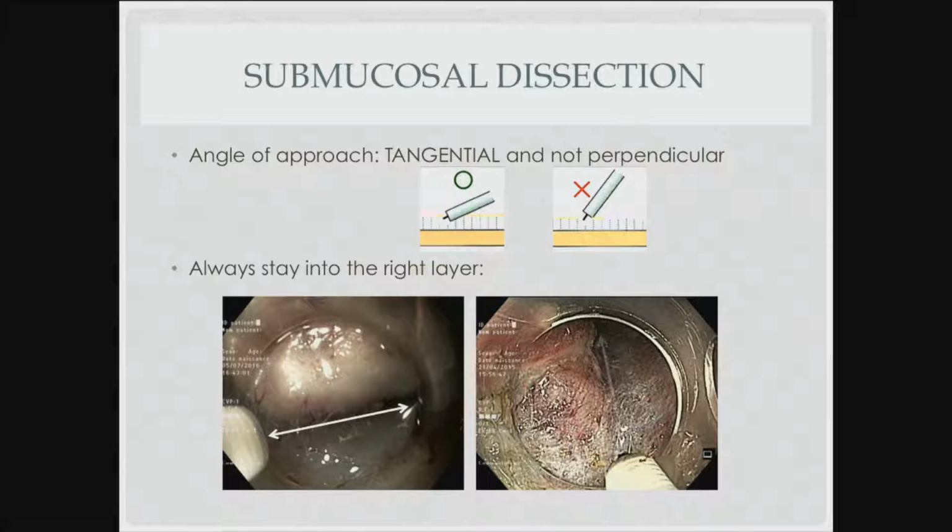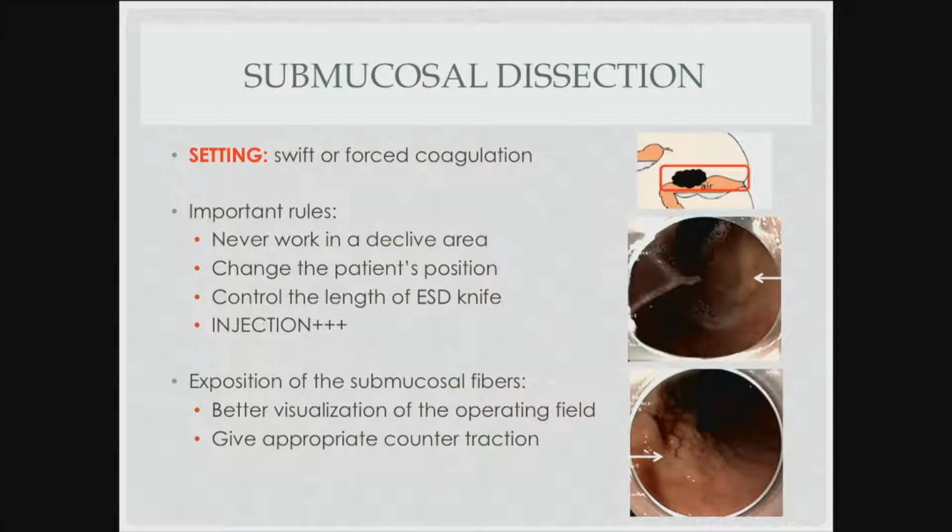The lesion. It's more difficult on the right, but there is fibrosis. When there is fibrosis, you have to ask where is the good layer, and you use the cap to recline to make the fibers in tension, but we can discuss.